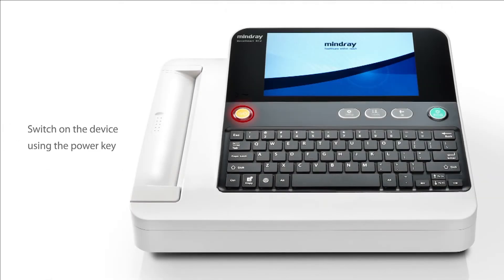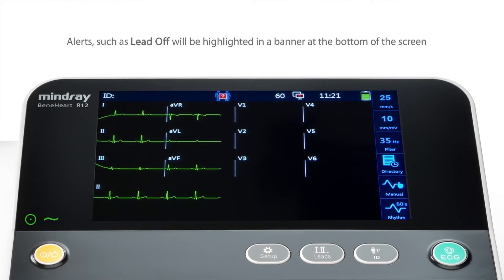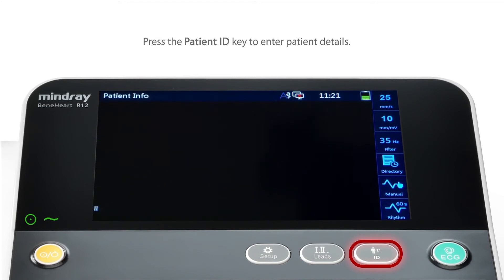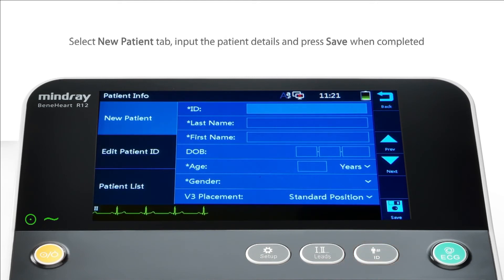Switch on the device using the power key. Alerts such as Lead Off will be highlighted in a banner at the bottom of the screen. Press the Patient ID key to enter patient details. Select the New Patient tab and input the patient details as shown.